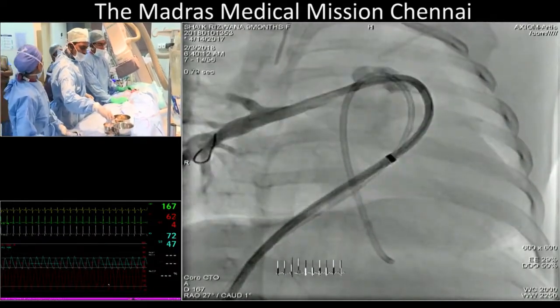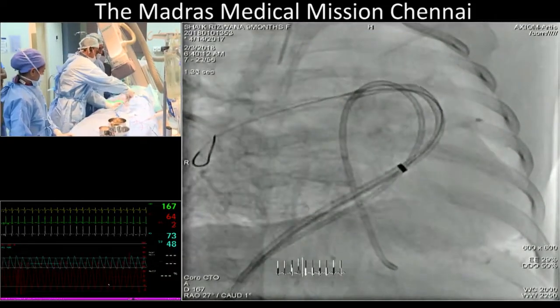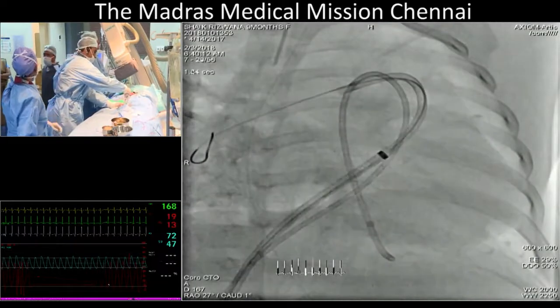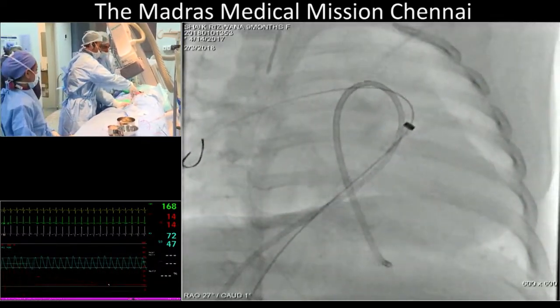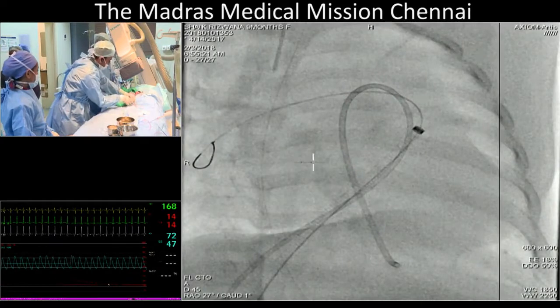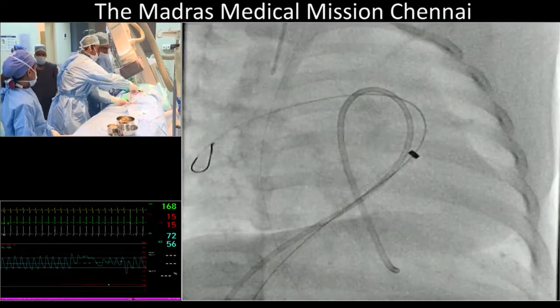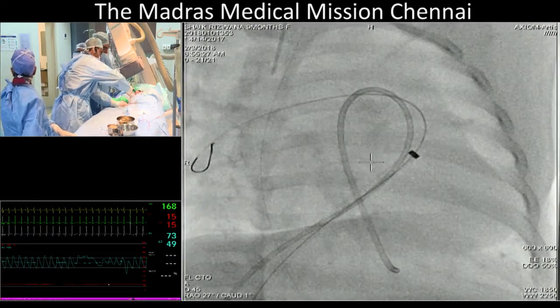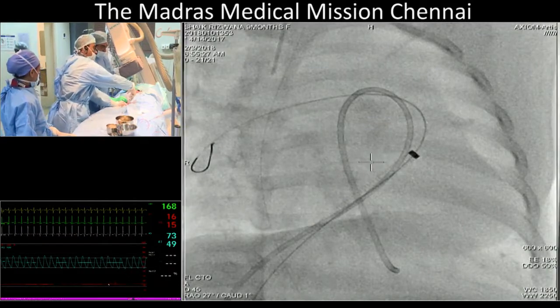Which type of balloon was it? Taishak, it's your balloon. I saw yesterday your balloon used for middle aortic syndrome, Takayasu. So we are using your balloon for a Williams as well. I have a high pressure Mustang balloon as well. Here, the balloon has totally opened.